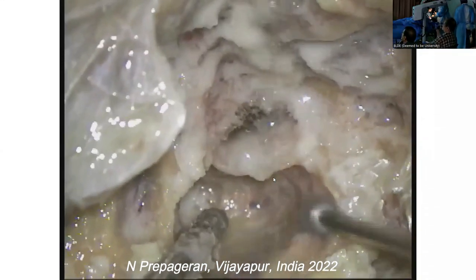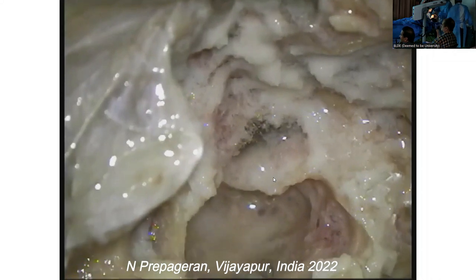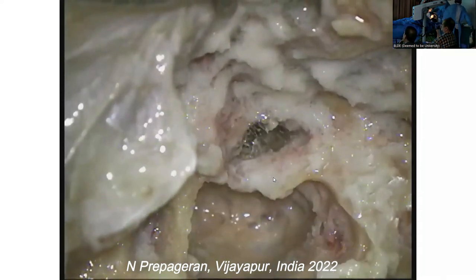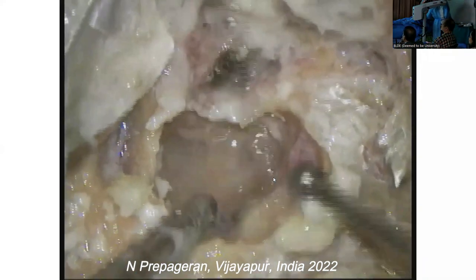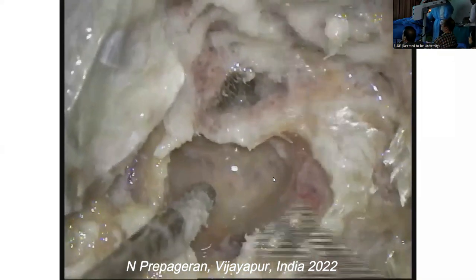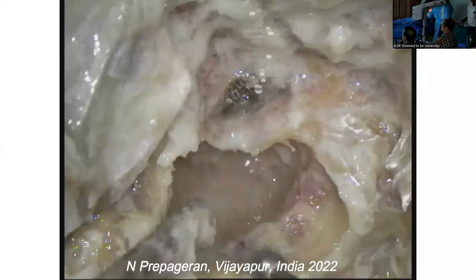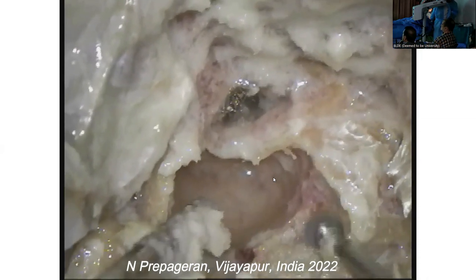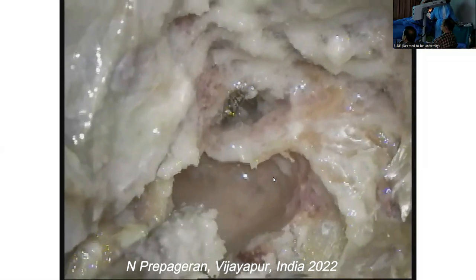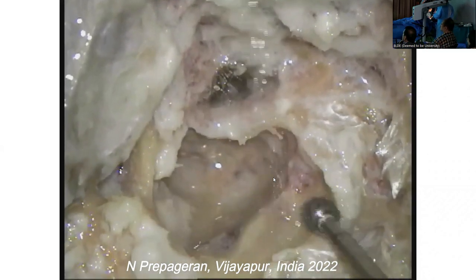So now we go behind the whole thing just came out. Okay, it's all part of the plan. The whole shaft just came out of the drill. Okay. Now I'm going to go, that's retro sigmoid, guys. Can you see? Yes. Sigmoid sinus, and I'm going behind the sigmoid sinus.